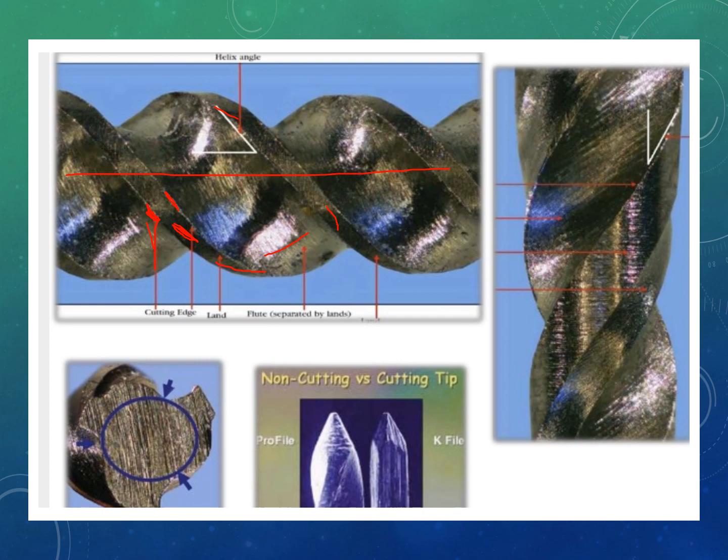So the debris will collect here, and it's not going to go beyond the apex, so the debris is going to collect within the instrument, so that you can take out the instrument, clean it, and then reuse it again. This is the advantage of it. So that's it. Again, I don't want to talk much about this and confuse you.